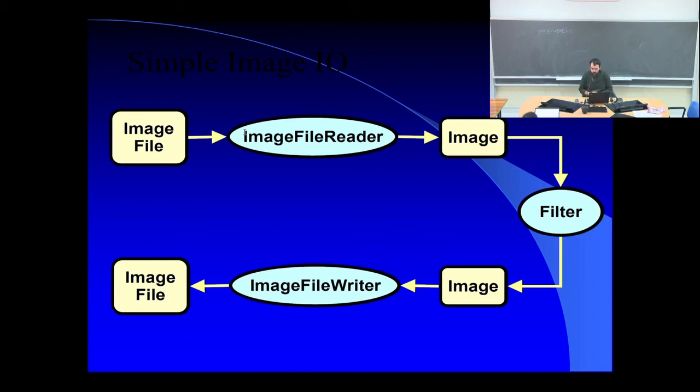Okay? So you'll see, let's suppose you want to do ITK edge detection. There are filters to do edge detection, and there's one specific one which is called gradient. So you go and search for the specific name, and you'll see that it's called ITK image gradient or something like this. You will load the image. For instance, here you have the image file.